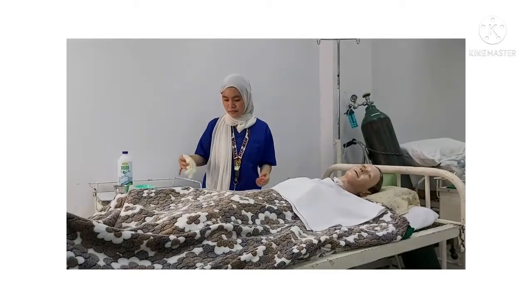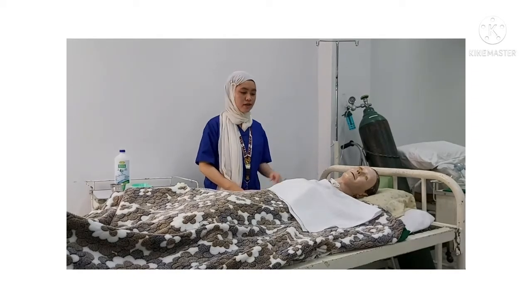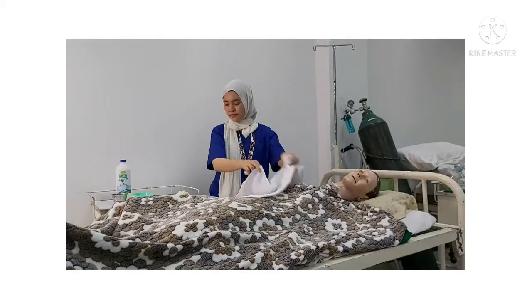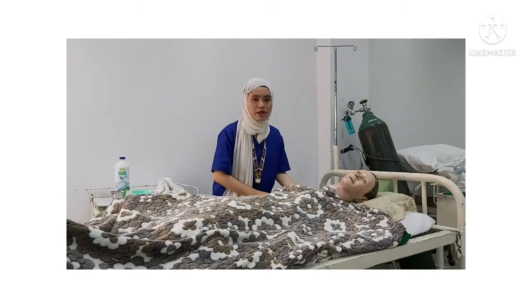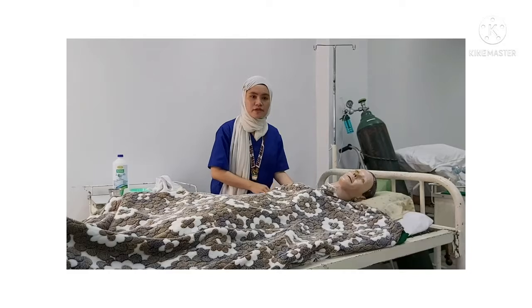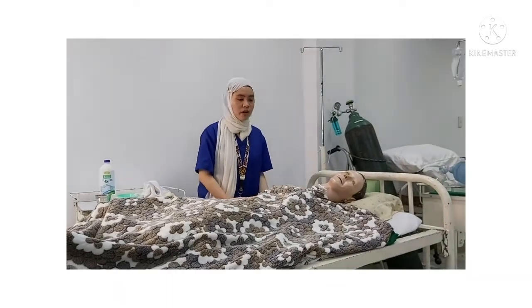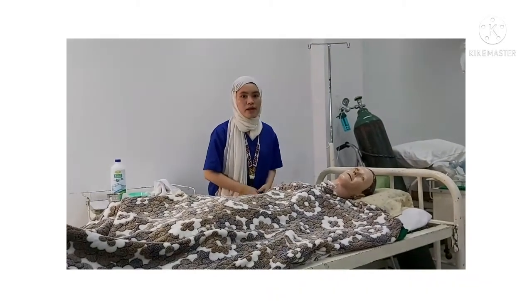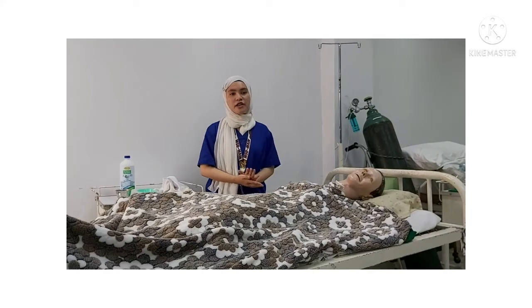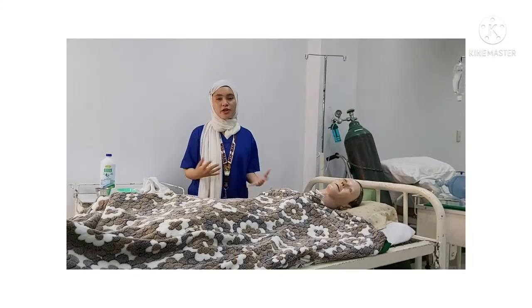Now place the patient in a comfortable position. Assess the effectiveness of suctioning by auscultating and observing breathing patterns. Now finally, chart the time, the characteristics of secretions, and the patient's reaction. So that will be all. Thank you.